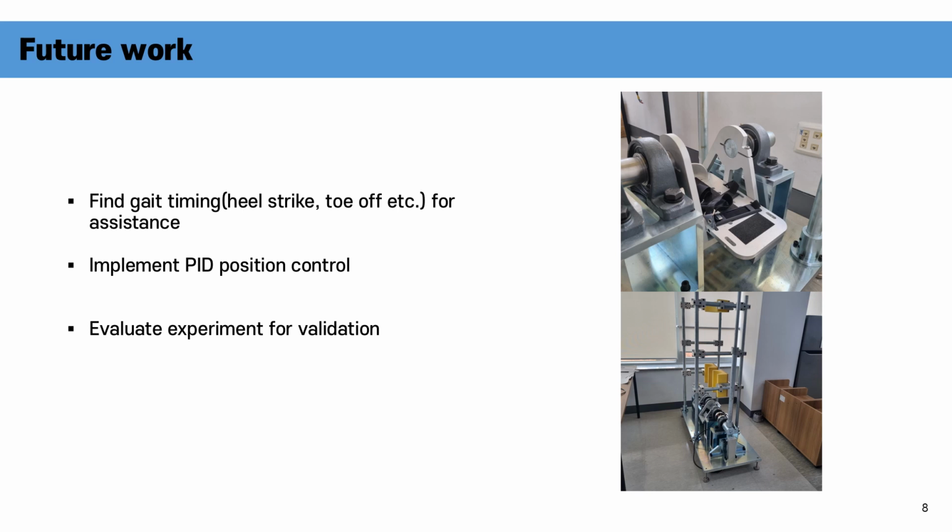The footplate axis of our apparatus can be measured using an encoder which is attached to its axis. The torque sensor is also applied, therefore we can measure the torque to rotate the ankle. Through this, we can determine the performance of our soft exosuit system by measuring the rotation angle of the ankle and the amount of force to assist the rotation.